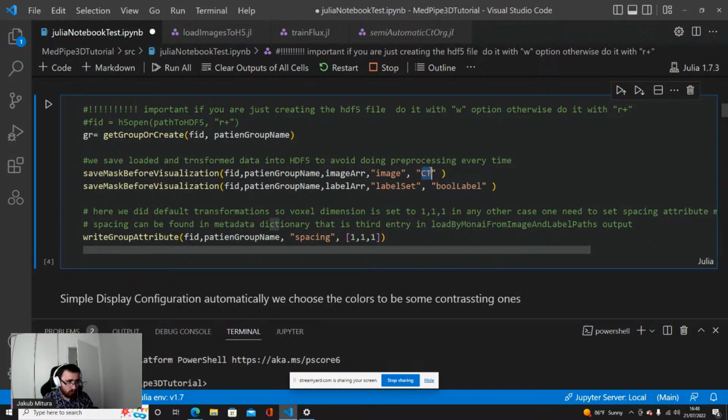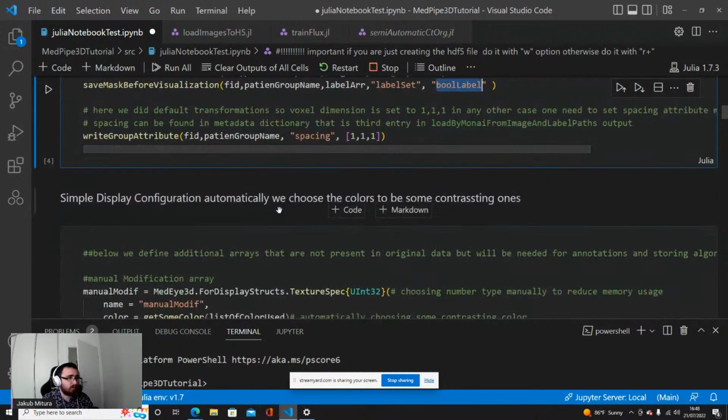All of the labels are described in the MedPipe, just for those that did not hear it, there are 3 tools that I implemented. You can use all of them or just one of them as you wish. One is for visualization, Medi3D. Another is for metrics, and the other is MedPipe, connecting those and the HDF5 data space.